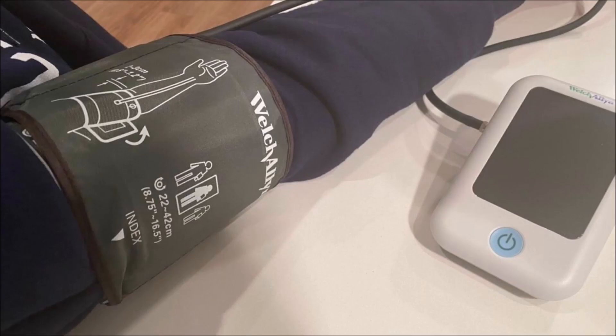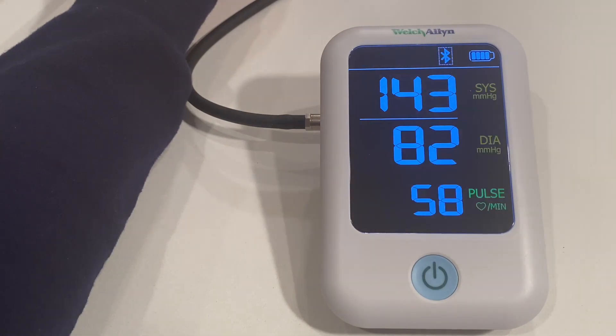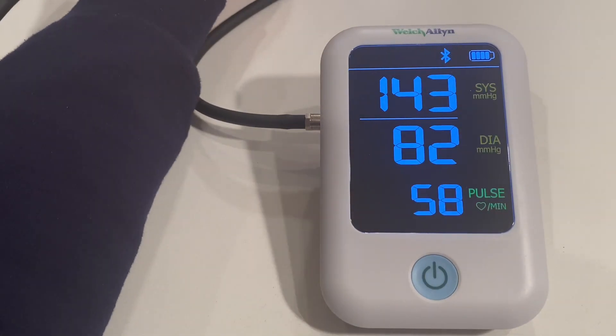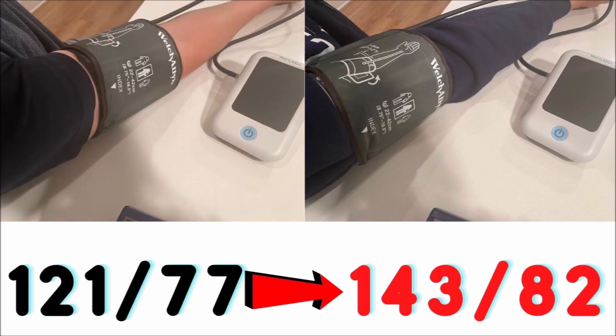The third measurement was taken over a thicker sweatshirt sleeve. This measurement took even longer than the last one, and the result was 143 over 82 — seven points higher than the second measurement and 22 points higher than the first one with the bare arm.